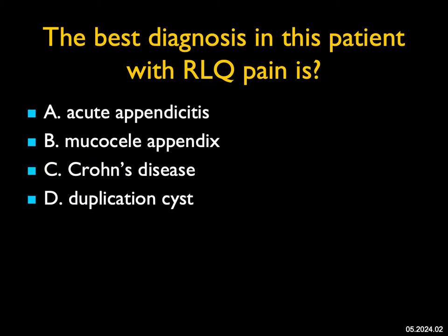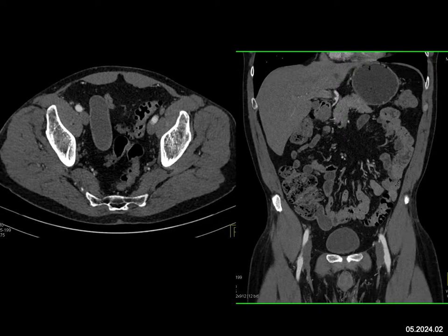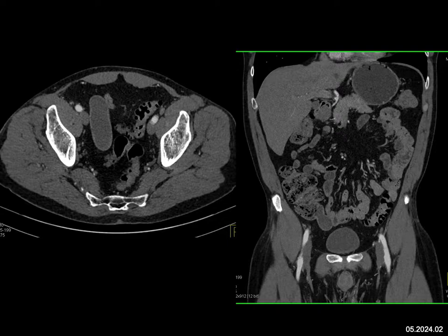The best diagnosis in this patient with right lower quadrant pain: when you look carefully on the axials and coronals, you see a large tubular structure. It's near the small bowel but not from the small bowel. You could think about a Meckel's diverticulum — it's within the region of the terminal ileum and cecum — but Meckel's is not one of the differential choices. I don't see any inflammation, so this is not acute appendicitis. You can have a dilated appendix with subacute appendicitis, but I don't see acute appendicitis.